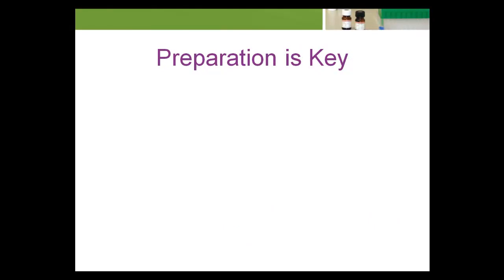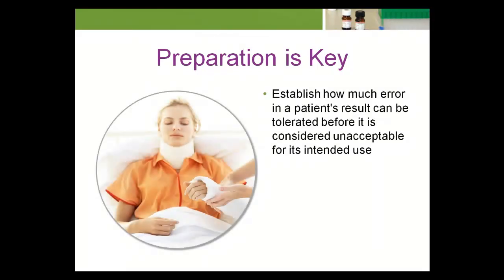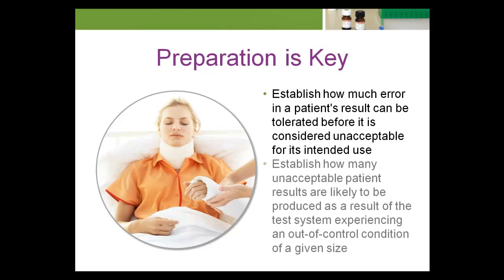Recovering from an out-of-control condition always has an element of difficulty, but it can be much easier with some preparation. One of the most important things you can do in preparation for analytical problems is to establish how much error in a patient's result can be tolerated before it's considered unacceptable for its intended use, and how many unacceptable patient results are likely to be produced as a result of the test system experiencing an out-of-control condition of a given size.